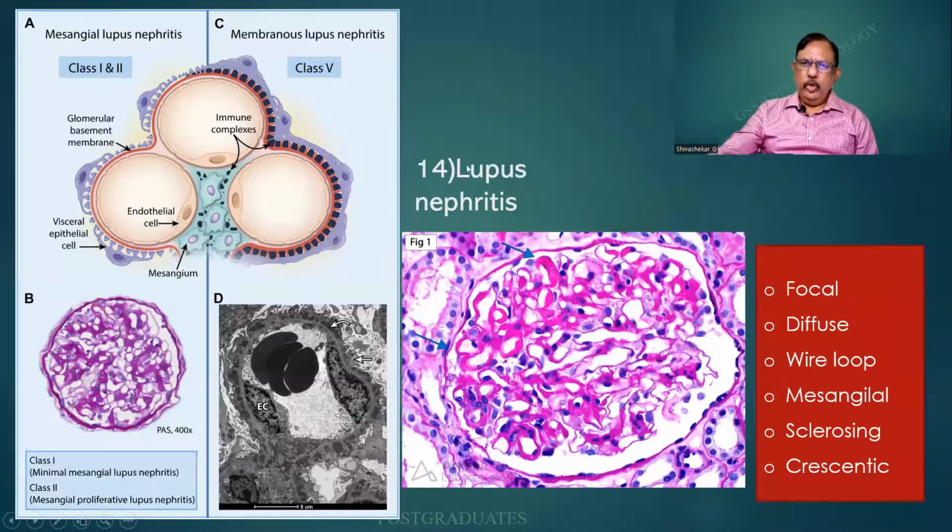Yet another one, the lupus nephritis. This is a little difficult picture. I hope you people will have the patience to see. Otherwise, stop, pause, and again come back. So this is what I am seeing.